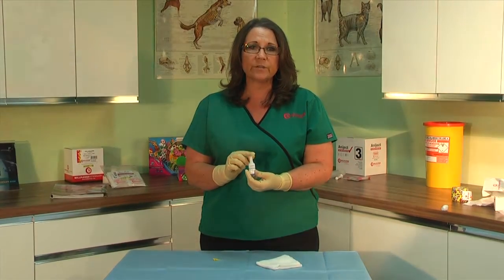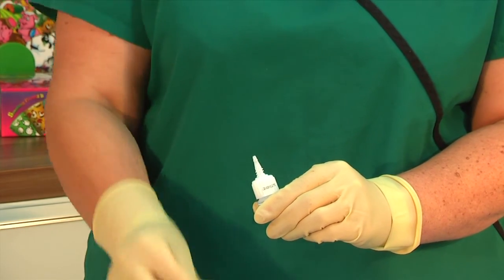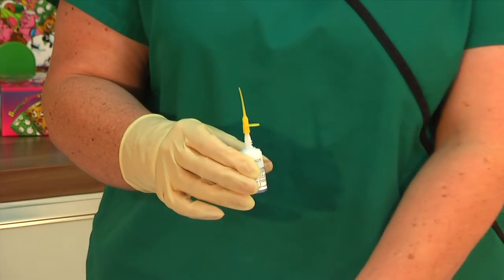Dermafuse must be used at room temperature. You will remove your bottle cap and place your applicator tip on the bottle, and you will push down to click it into place.